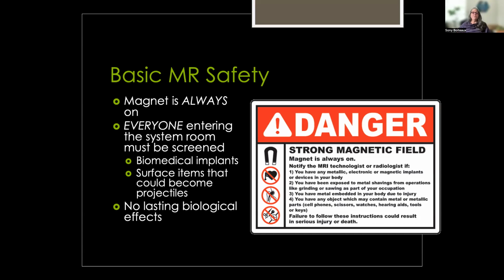Now, the great news with MR, using the limitations that we have thus far, is that there are no lasting biological effects when it's used properly. It can become deadly when used improperly, right?